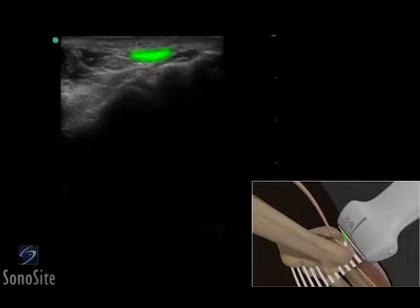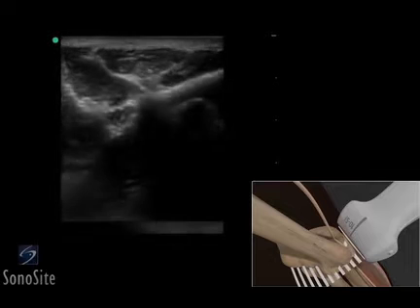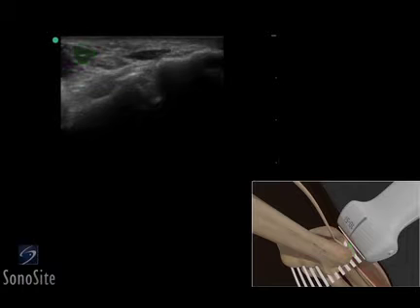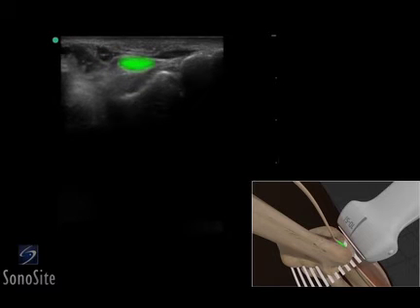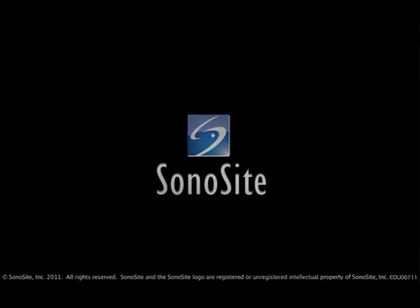The ulnar head of the flexor carpi ulnaris muscle can be seen as a hypoechoic structure near the olecranon process. The humeral head of the flexor carpi ulnaris muscle appears similarly on the medial side of the image. The ulnar nerve can be seen as a hypoechoic, rounded structure between the two muscles.